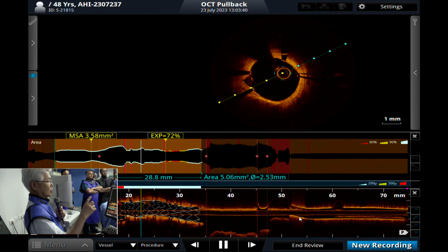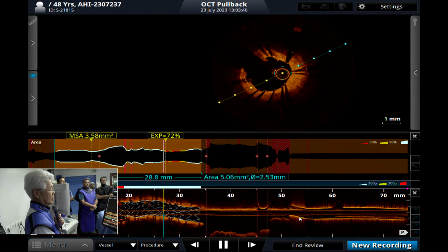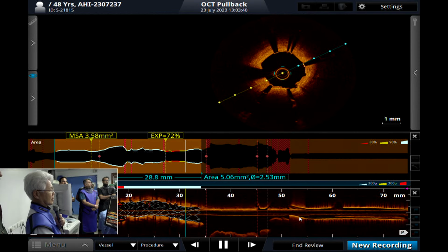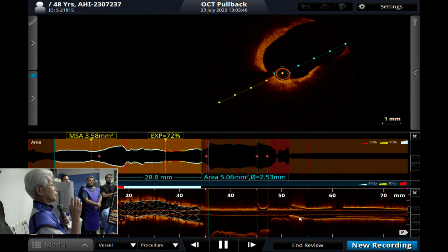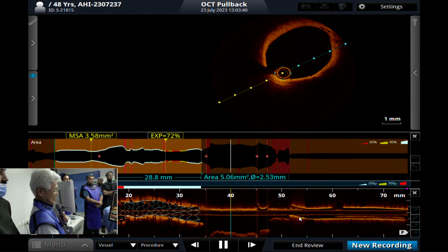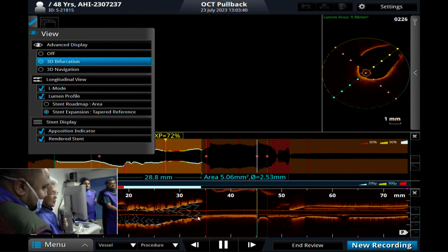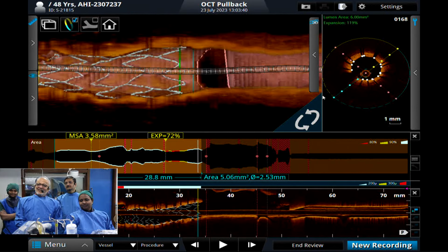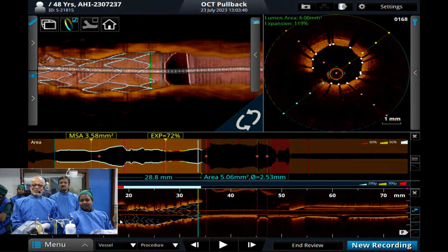Before stenting, we measured 3.5 mean diameter at that portion, right? And here might be a small under expansion. And the proximal side is just proximal. Perfect. Right. Congratulations. Great technique, right? Perfect position. So what next? 3.5 and high pressures in that aneurysmal area, and that's what we will do.